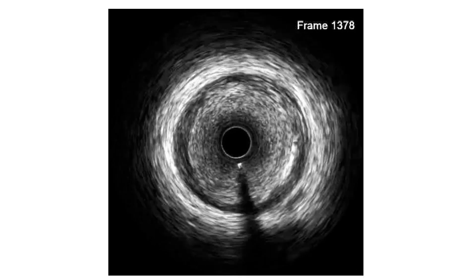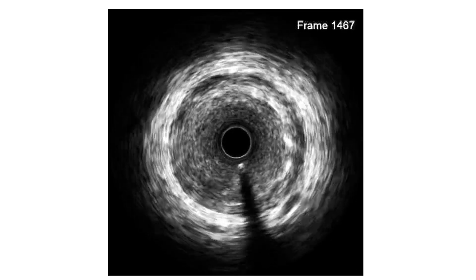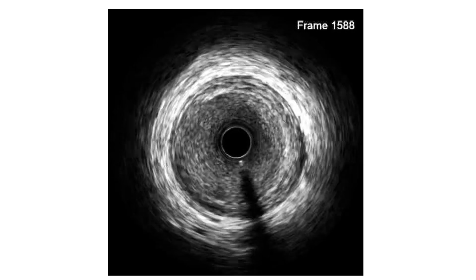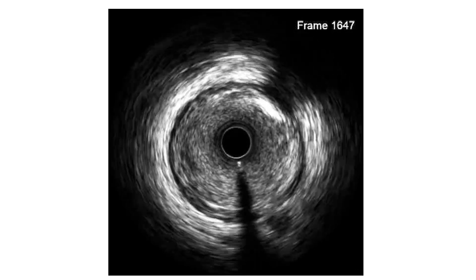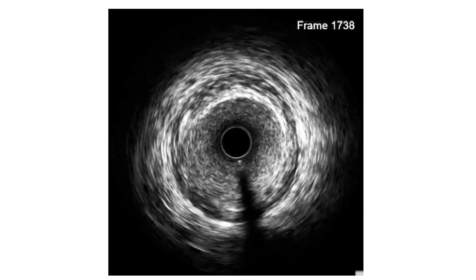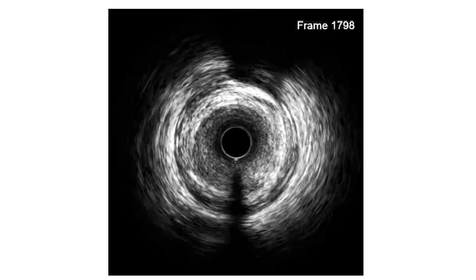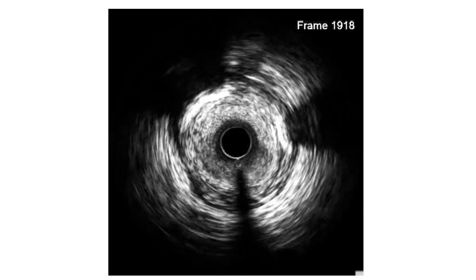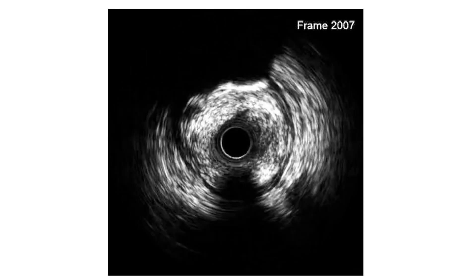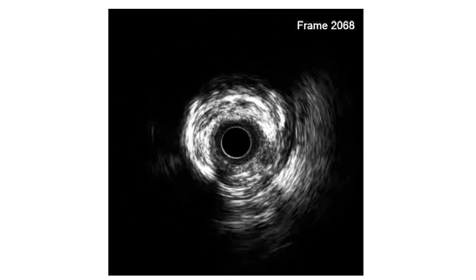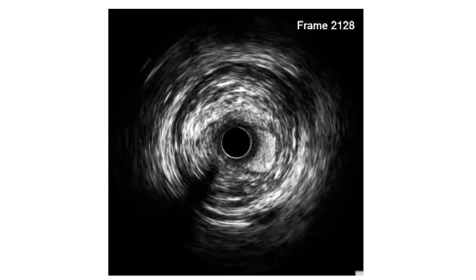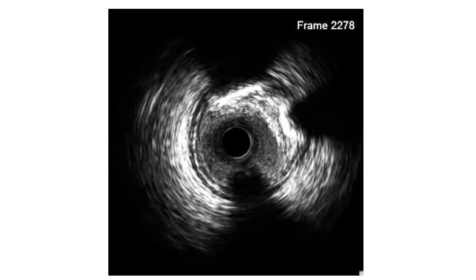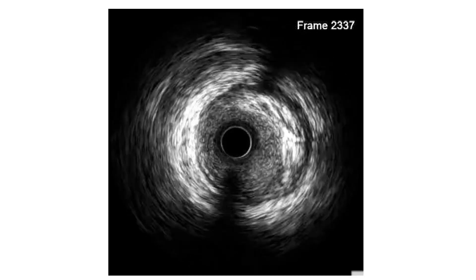This is further pullback at the mid-part of the RCA, and then we come to the most tight part — there is some calcification. Then the proximal part of the RCA, which also shows the plaque extending up to the ostium of the RCA.